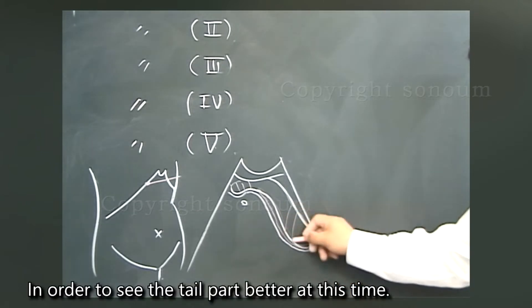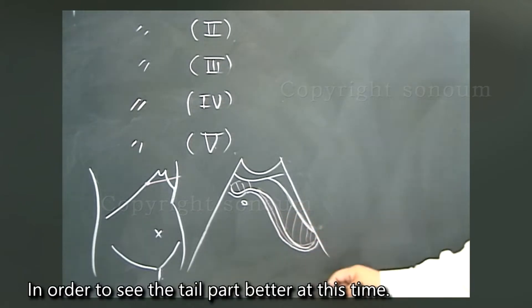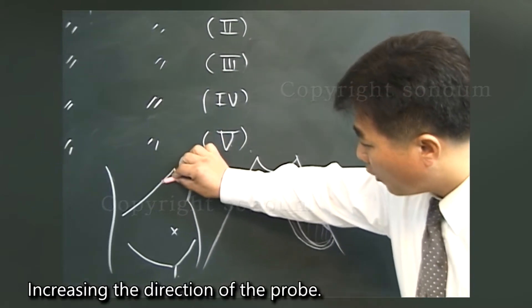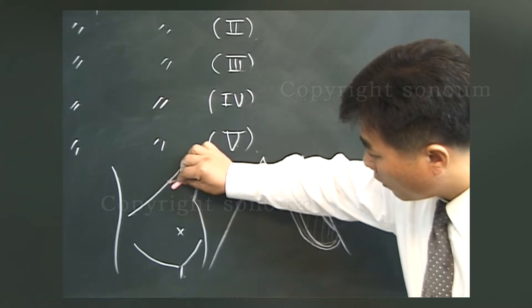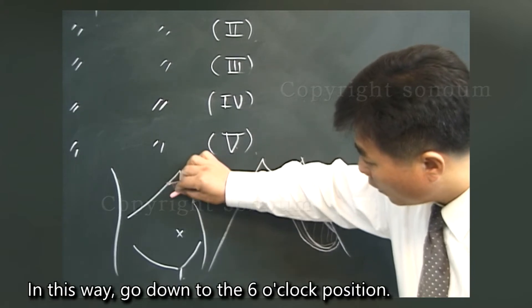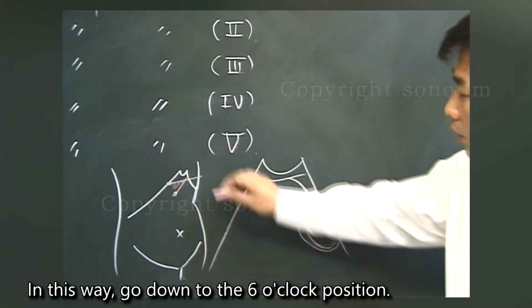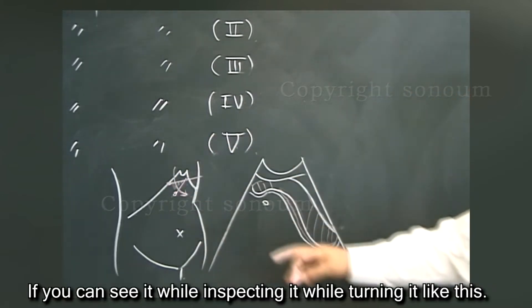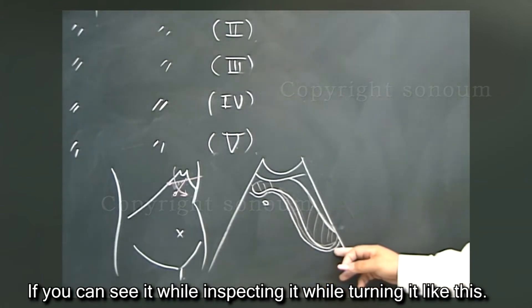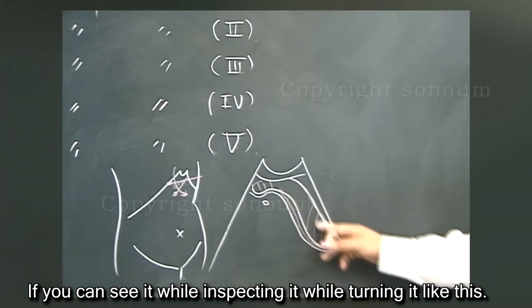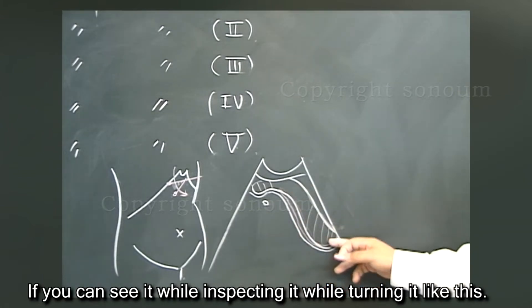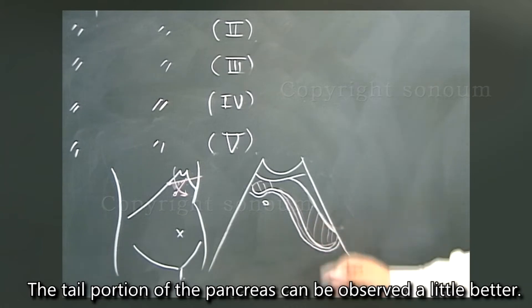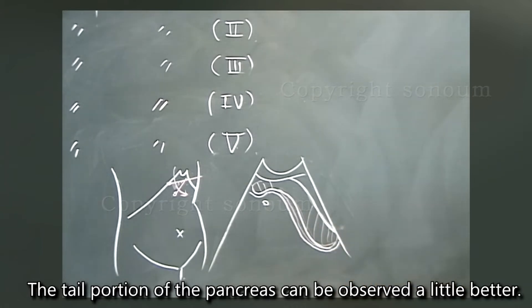In order to see the tail part better, increase the direction of the probe in this way and go down to the six o'clock position. If you can see it while turning it like this, the tail portion of the pancreas can be observed a little better.